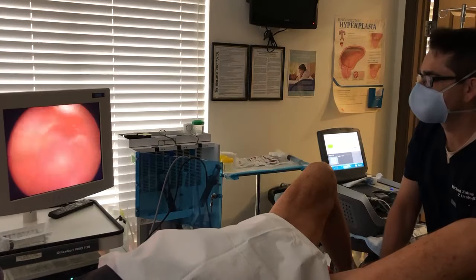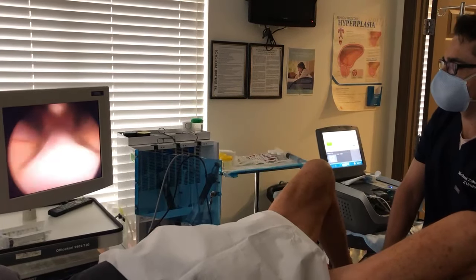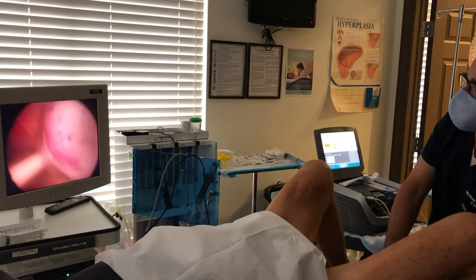Hopefully we can get in. So by getting rid of the tissue, we're able to relax the bladder neck here. Then we'll come back one centimeter and do a couple more.